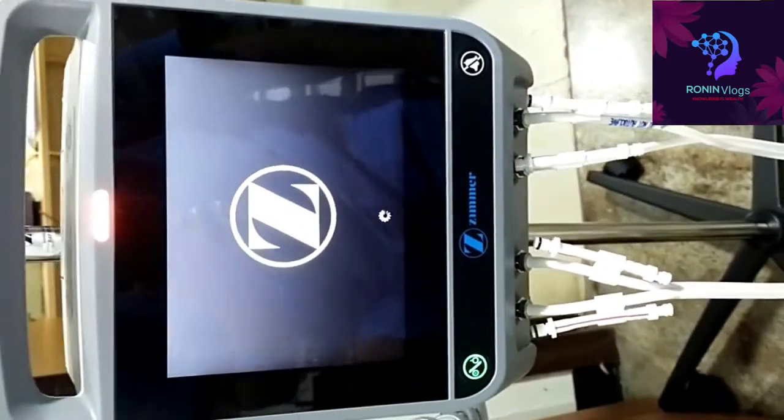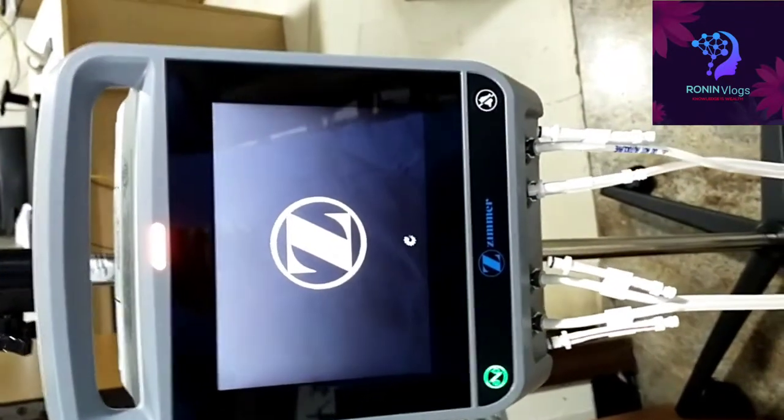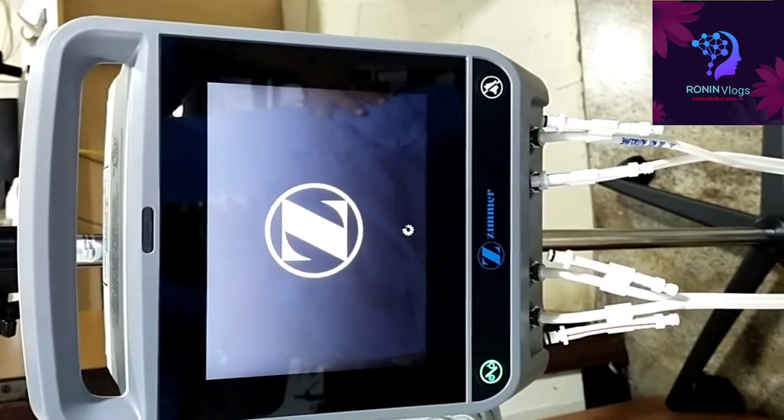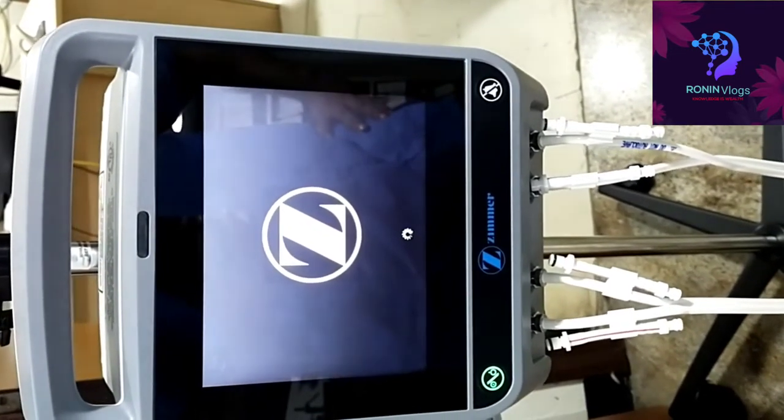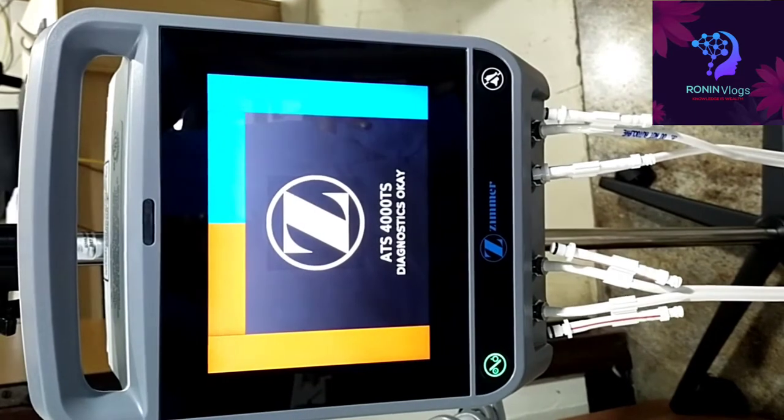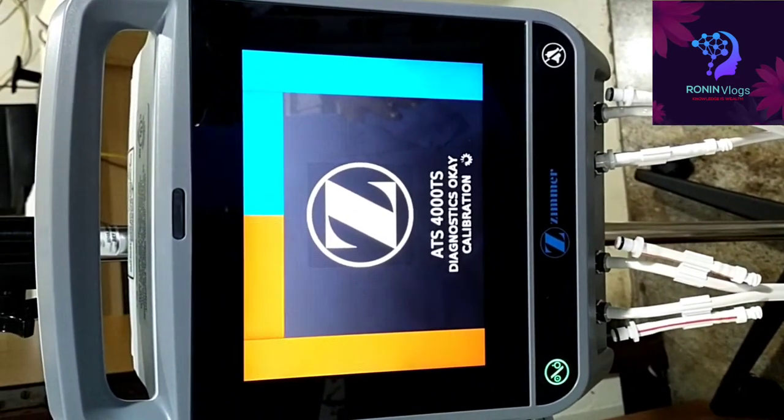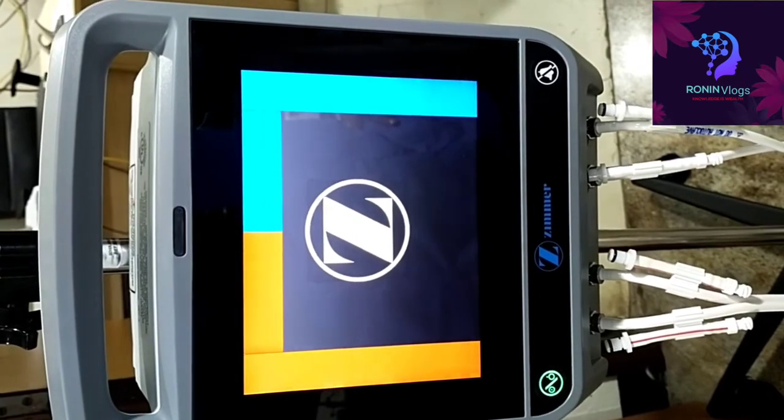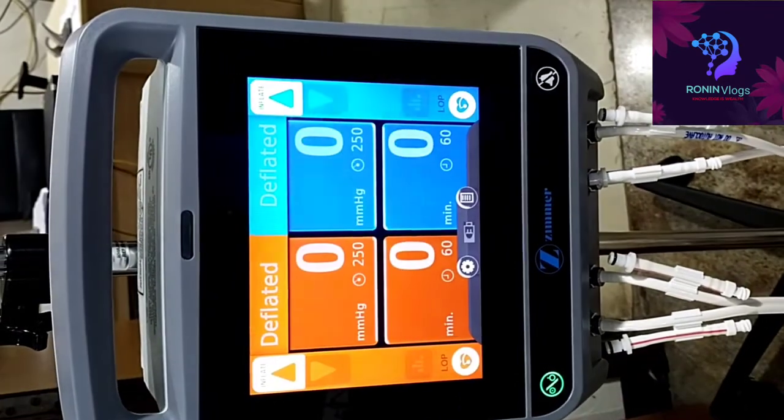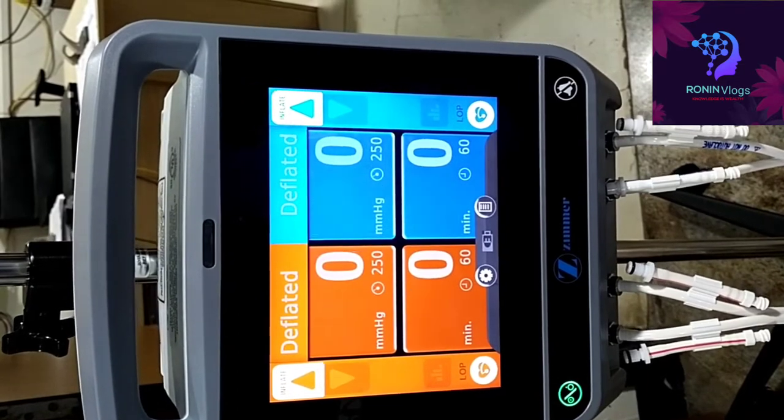Now switch on this button. The model name and self checking will happen. It is 4000 TS. Now automatic calibration also done.